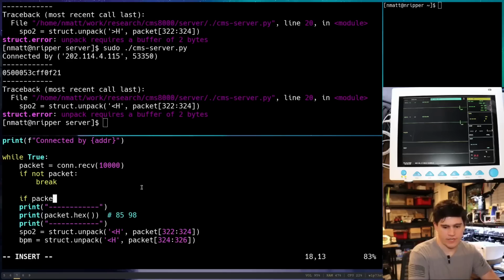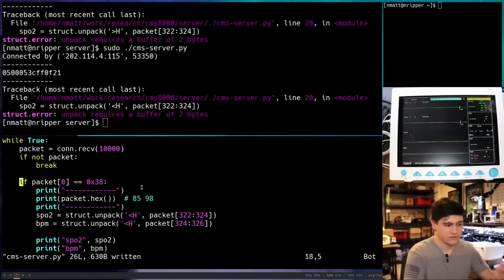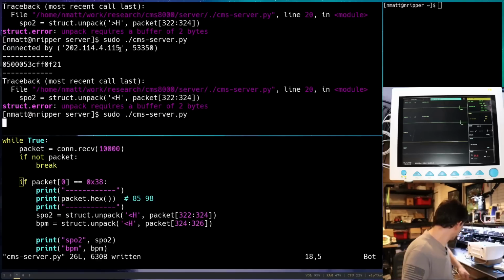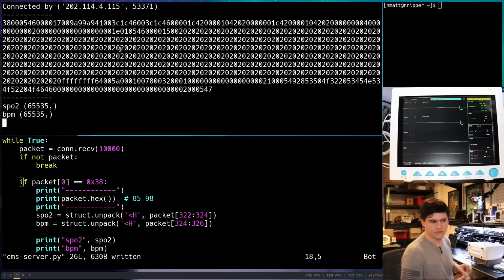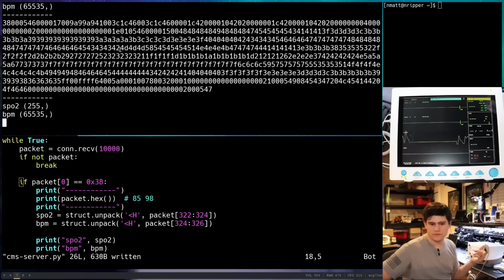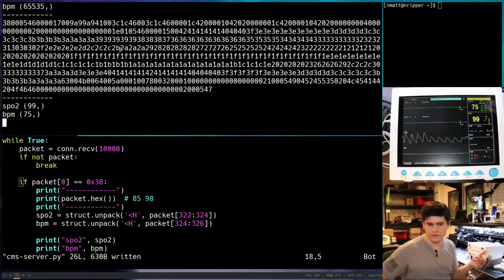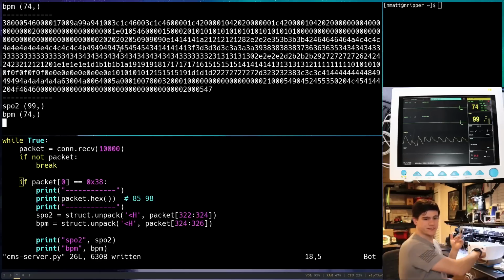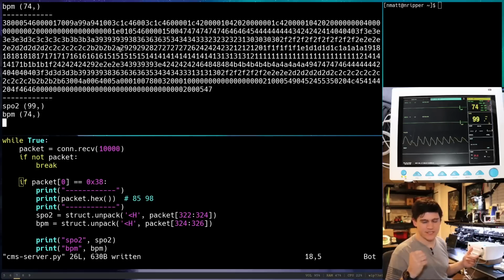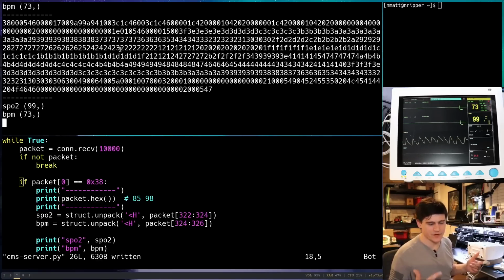We can say if packet at spot 1 equals 0x38, then we do all our analysis. Otherwise, we don't care right now. That's what our problem was. Haha. Now, learning things on the fly here. All right, cool. Oh yeah, I forgot those are tuples. I have to like do like array spot 0. But we can see that we're matching what we see on the screen. That's awesome. So now we're parsing the data for the SpO2 reading and the beats per minute.